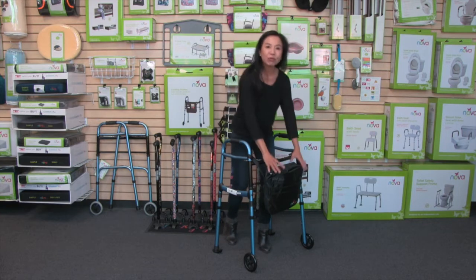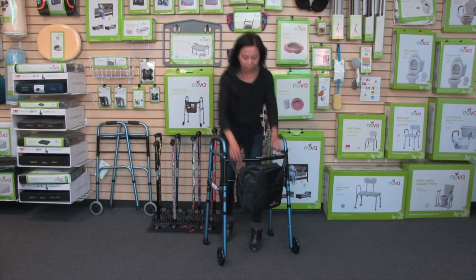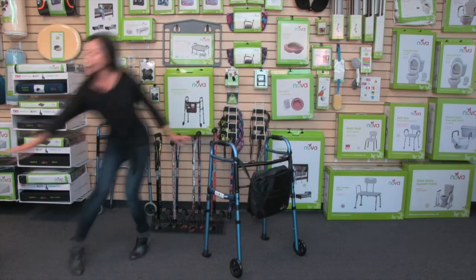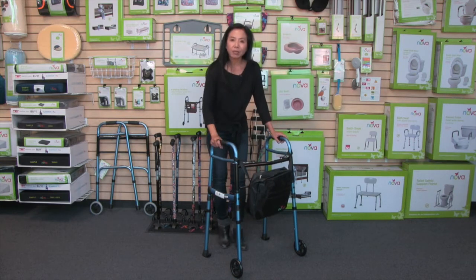It comes with this removable bag. I love this because then you can carry your personal belongings. There are lots of pockets in the front, and then there's a middle compartment that's very roomy. You can put things like an iPad — it fits right in there — or a small sweater, so you've got your personal items right here.